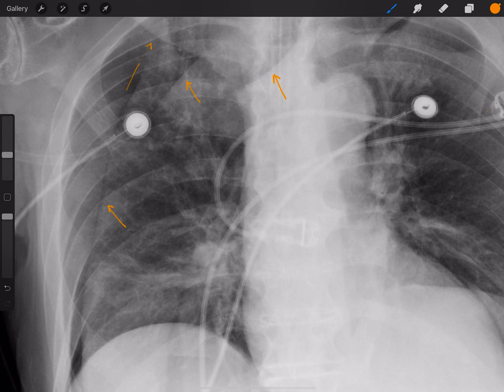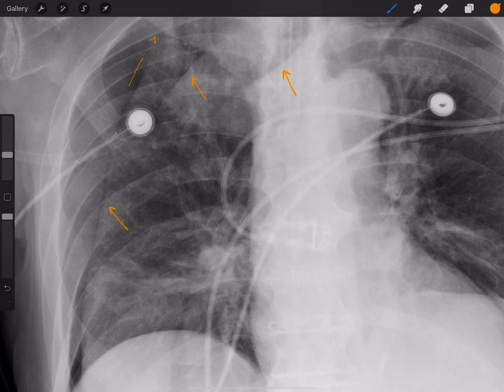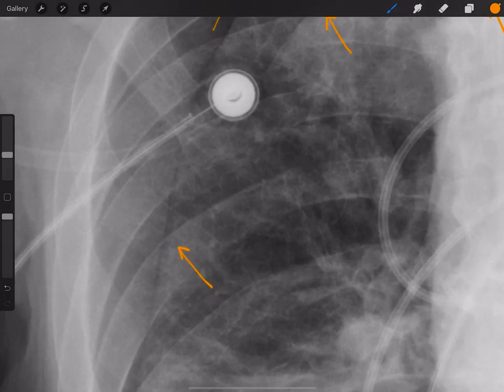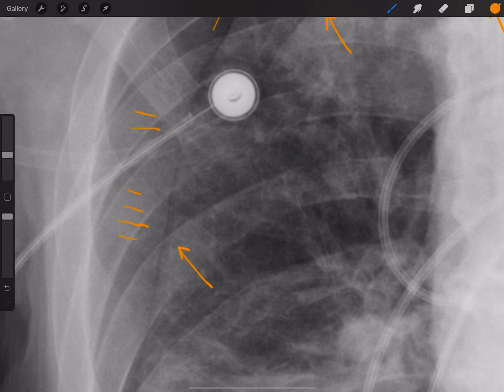The third reason — and let me zoom in here — is that out past that line, we can still see lung markings lateral to it. If there are lung markings lateral to the line, then it can't be a pneumothorax.